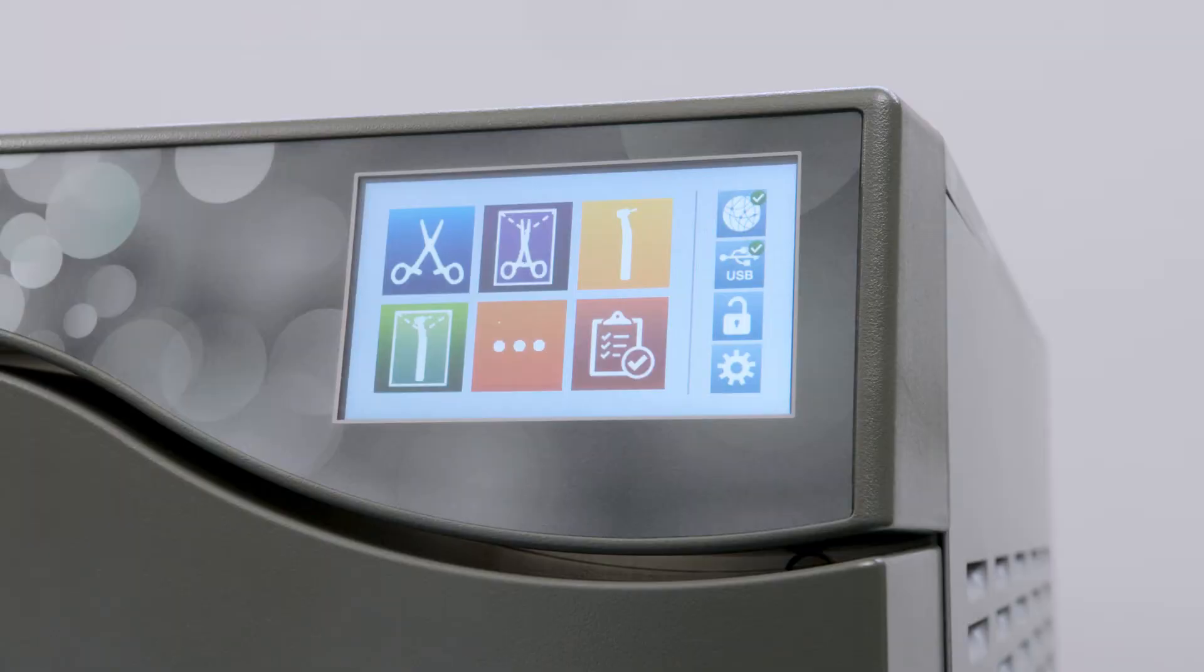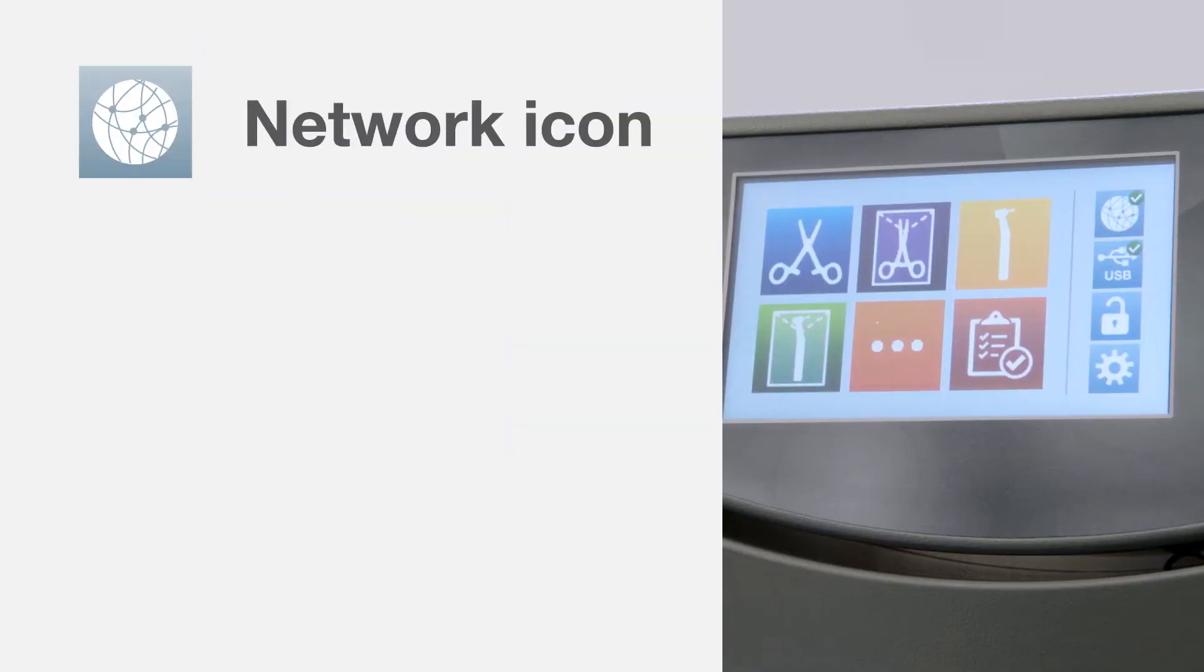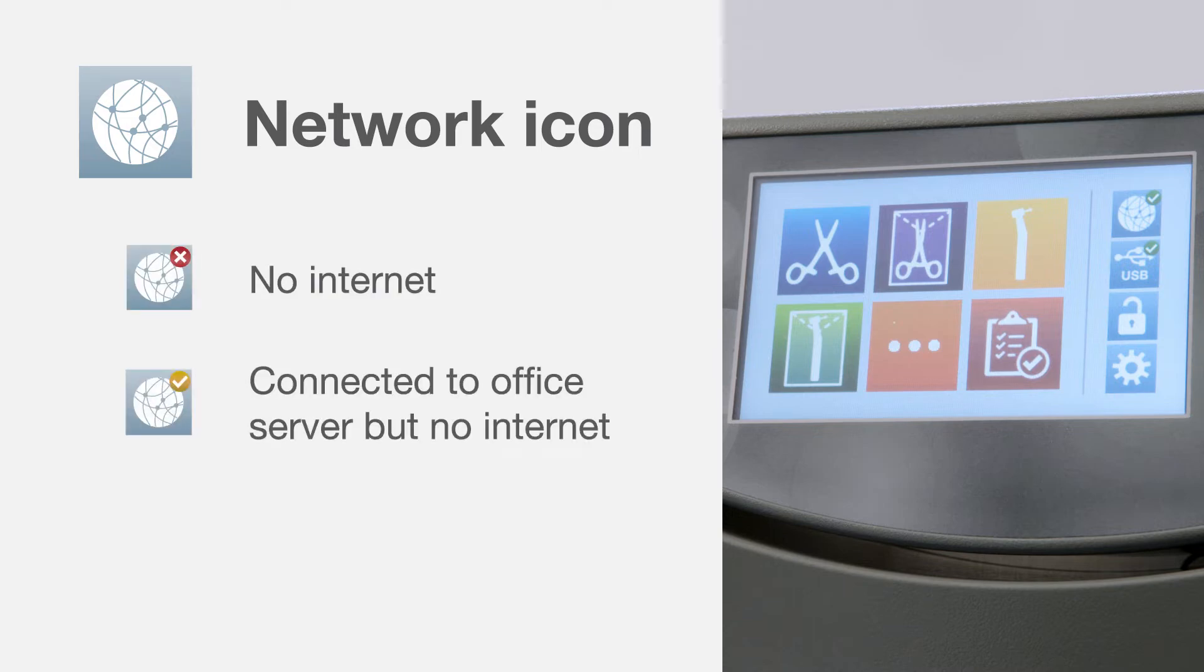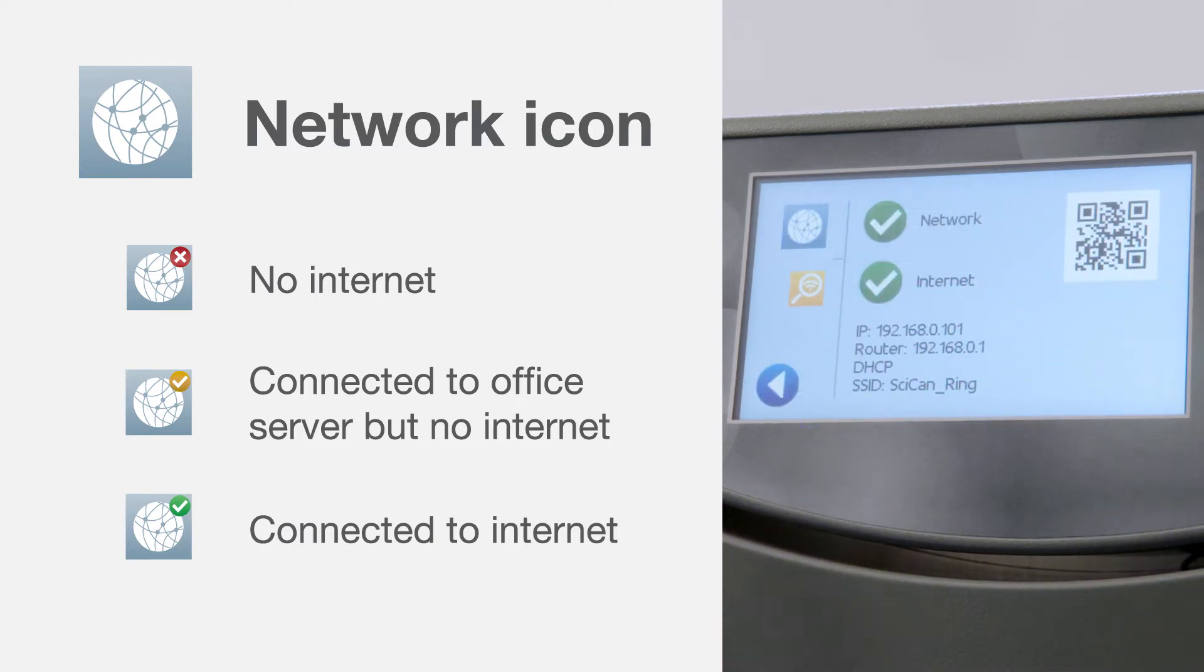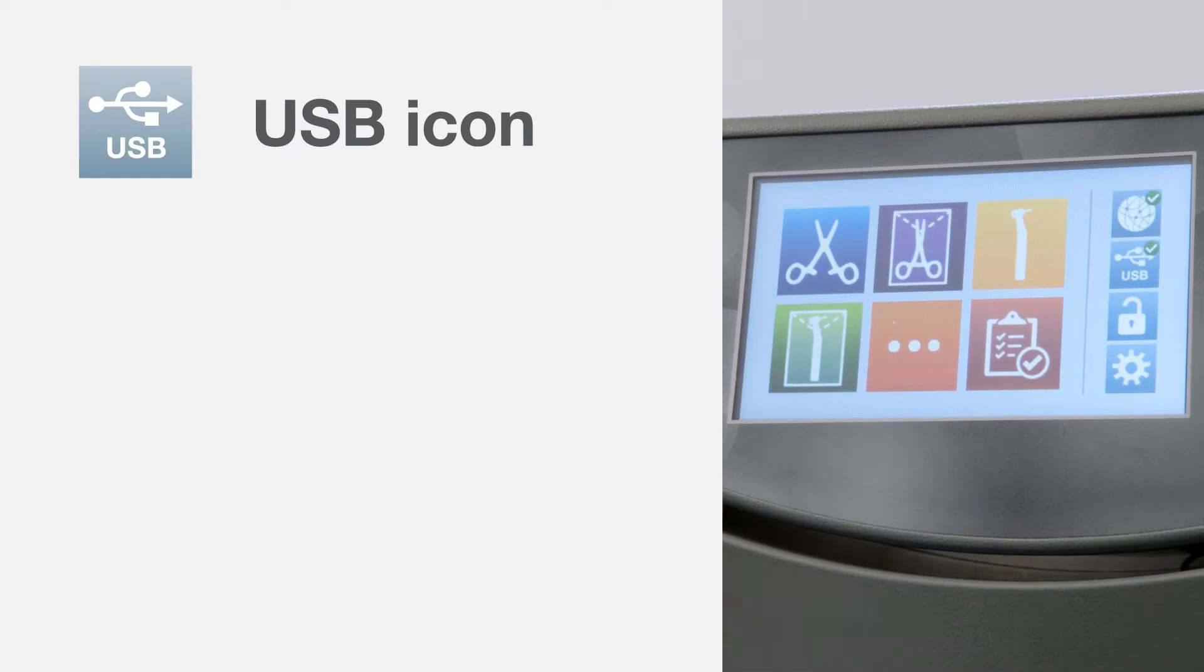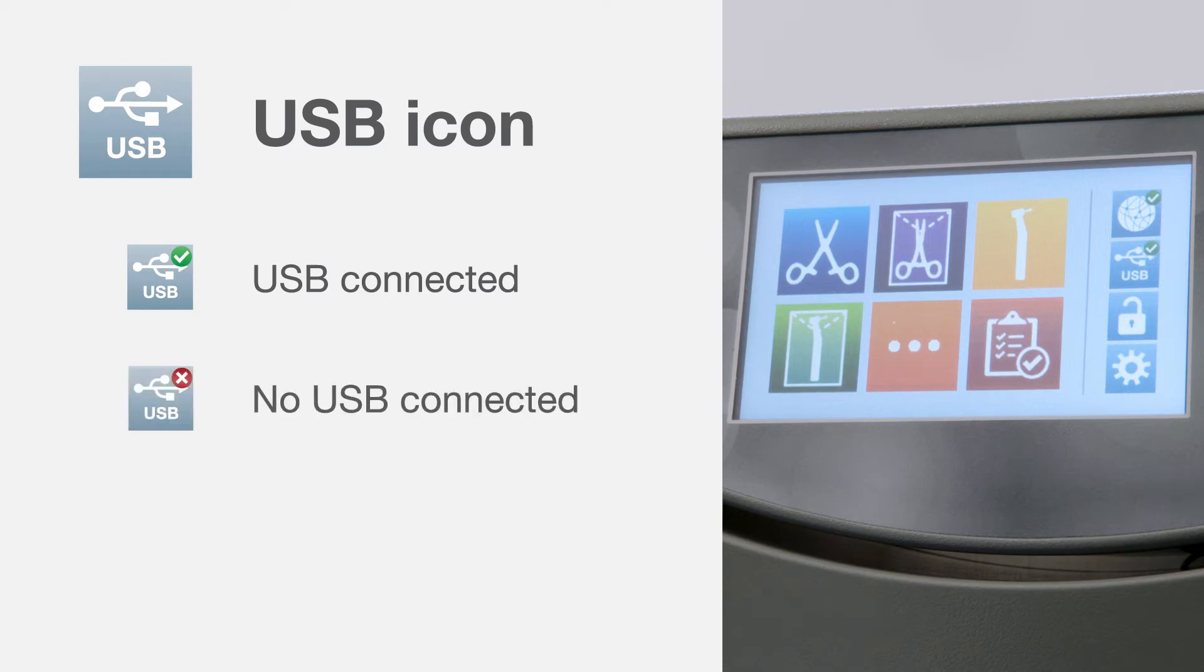Along the right side of the touch screen are some additional system icons. The globe icon shows the status of the network connectivity. It is used when connecting to the internet. A red X indicates there is no internet connection. A yellow checkmark indicates the unit is connected to the office server, but not to the internet. A green checkmark indicates the unit is connected to the internet. If the unit was not connected to the internet during setup, press this icon to connect your unit via an ethernet cable or Wi-Fi. Below that is the USB status icon. A green checkmark indicates the USB key is connected and a red X indicates there is no USB. The icon will turn yellow. The USB is recording cycle information.